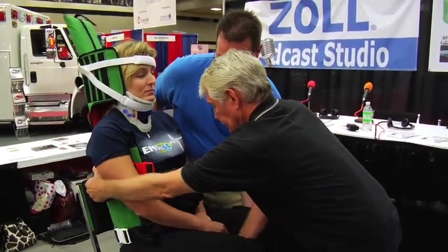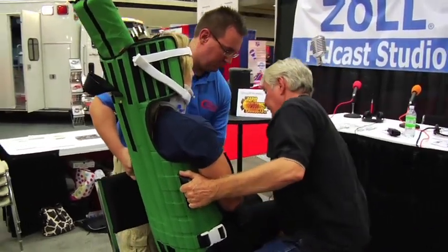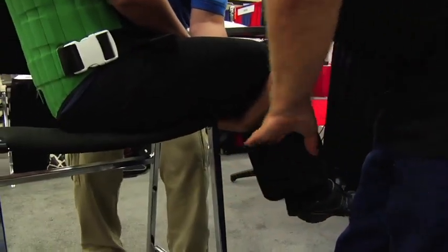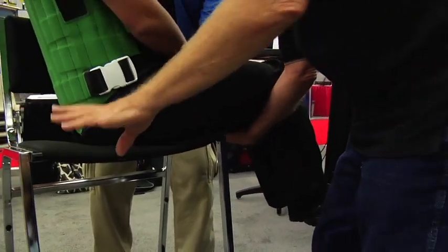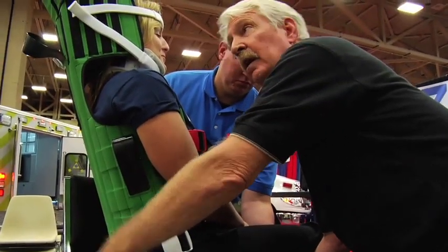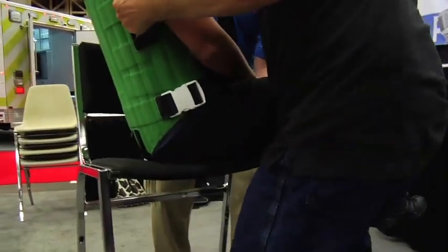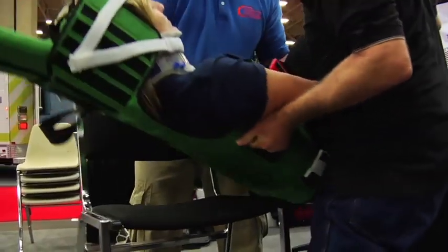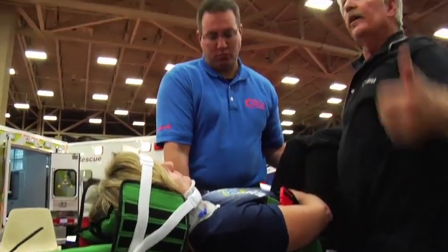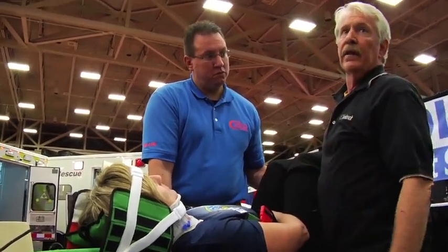Okay, turn her — just turn. You rotate your patient. If you watch this very closely, we're going to lay her back and keep her suspended above the seat. If you put the top of the long spine board to the far side of the seat, her head will go exactly where it needs to be on the board. All we're going to do is lift the legs and put the head down. The head is now positioned on the spine board where it needs to go. We didn't vertically lift her, we didn't rotate her lower spine — she's now laying on the backboard ready to go out of the car.